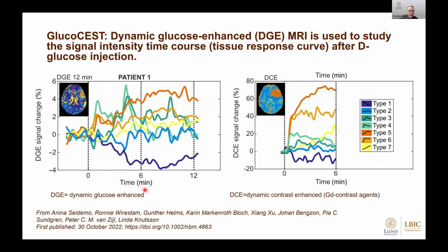You see the same experiment done with sugar. What you can see at least is that this curve, the lowest, is the lowest here, and this dark orange is also the highest here. So relatively, they are reproducible, but you can also see that the glucose experiment is way more noisy, and it's not up to the level you want to reach with contrast agents.